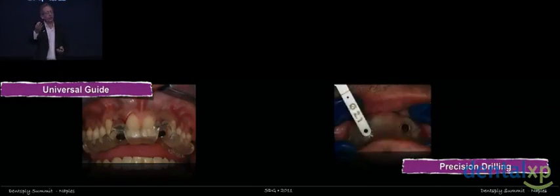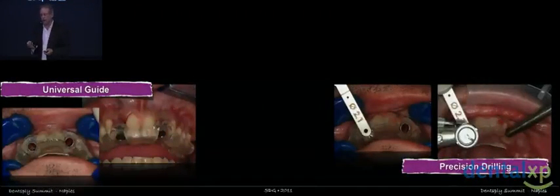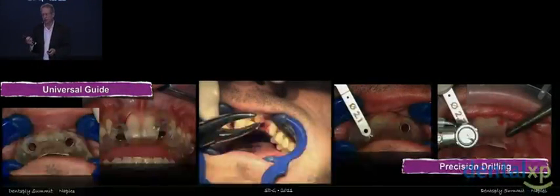And they actually are introducing a new drill set here at this meeting. And so having that capability allows us to go in there and accurately take that plan and go to the surgical intervention.